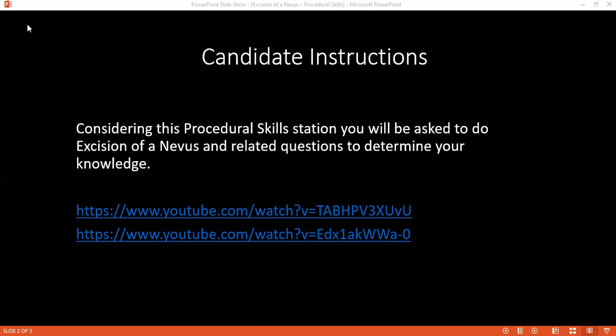Before proceeding, I would like to get a signature on this written consent. After confirming the WHO checklist, I would like to proceed.